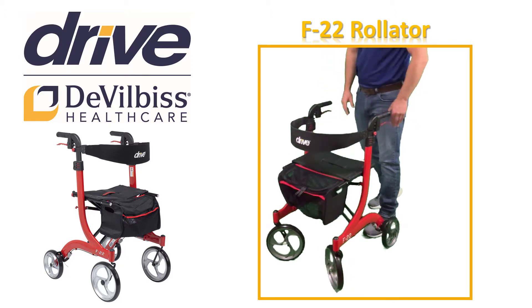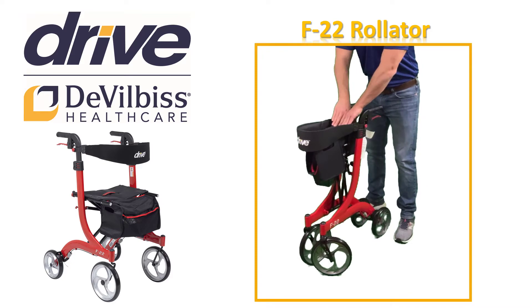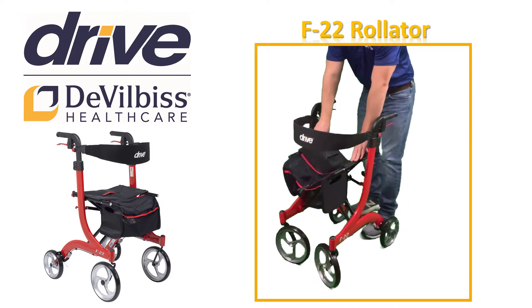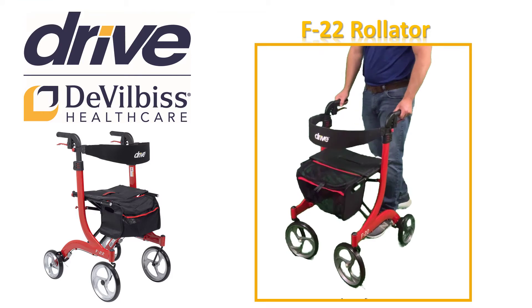For your safety, never use the F22 if it is not locked into the open position. It is now time to make the two adjustments in order to customize your F22 Rollator so that it fits you properly and is the safest for your individual needs.